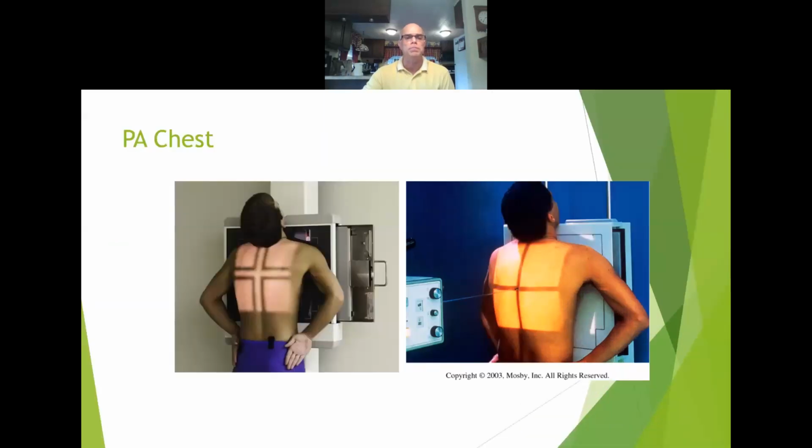So for the PA breathing instructions, I'm on page 105, let me go ahead and share this PowerPoint. What it talks about is actually the breathing instruction and what happens when we're giving our patient our breathing instructions. So this image here, I think you've probably already seen it. It's from your book, on page 107, proper positioning. I think the other image actually came from the edition before the one you have.